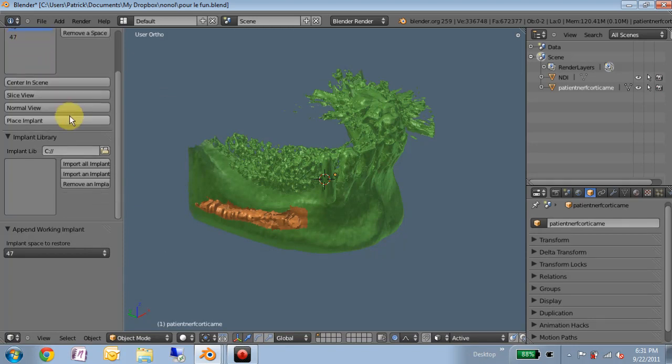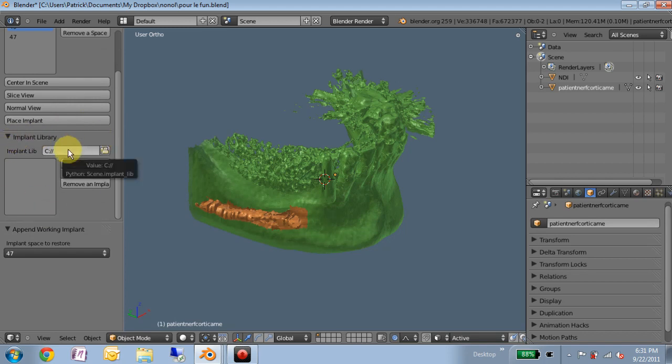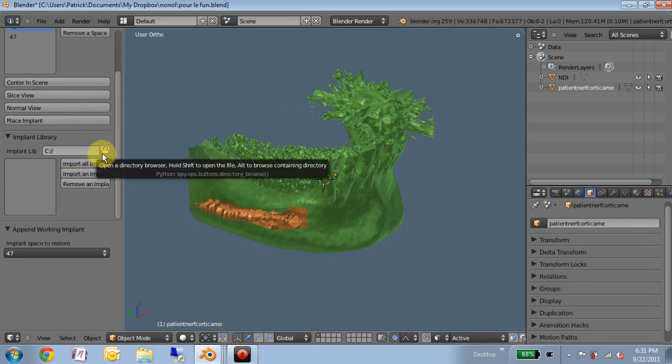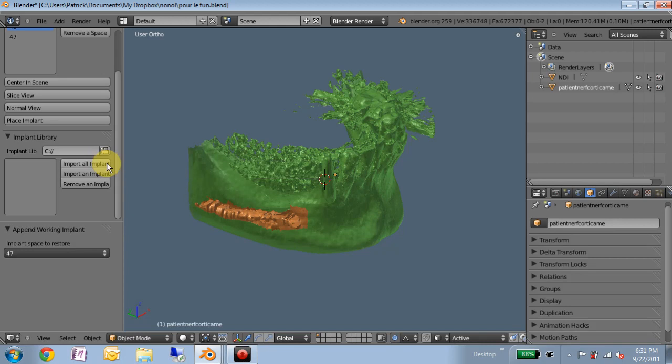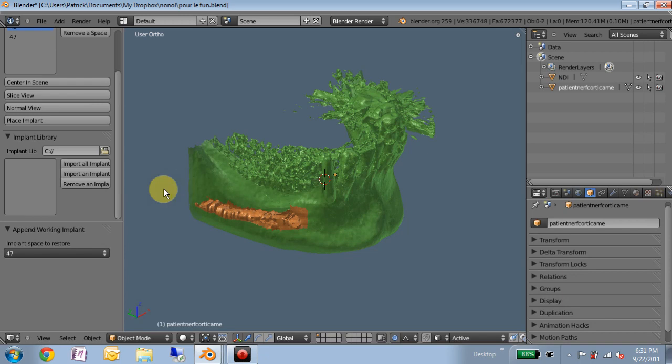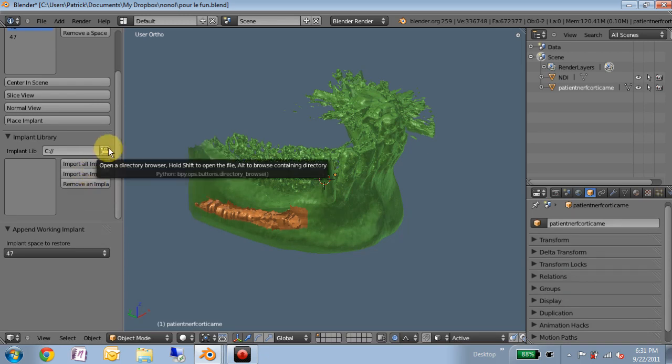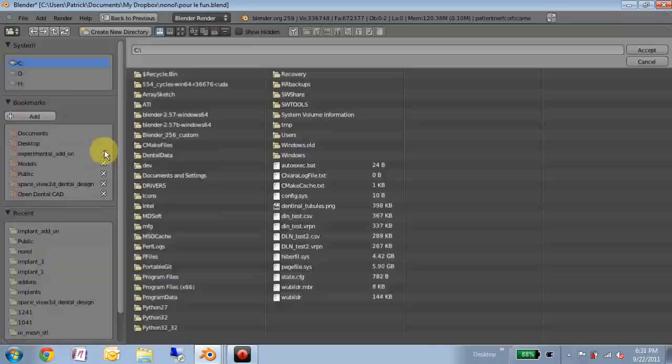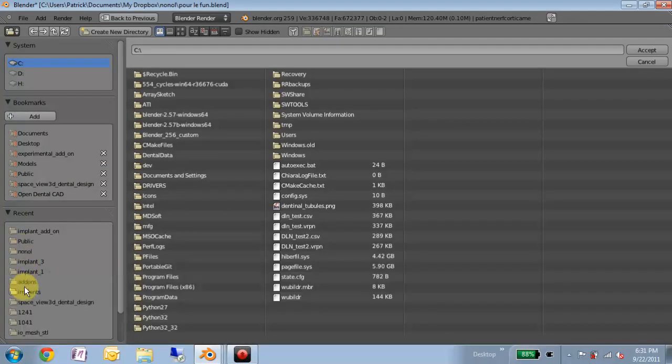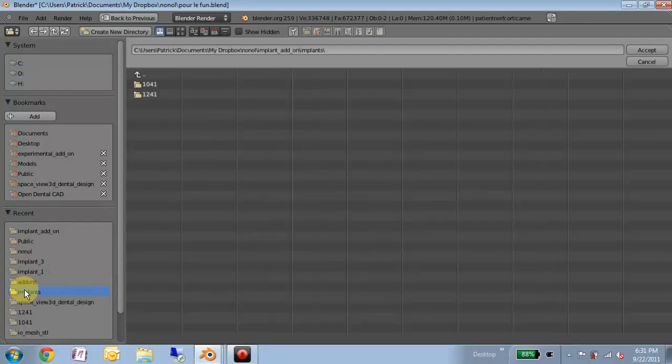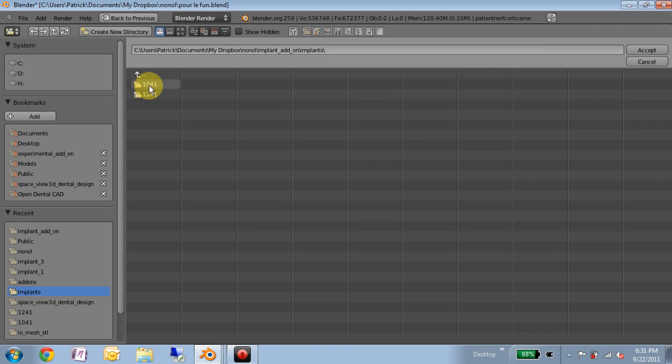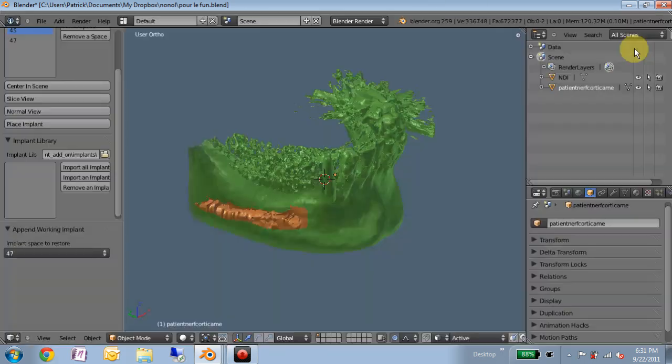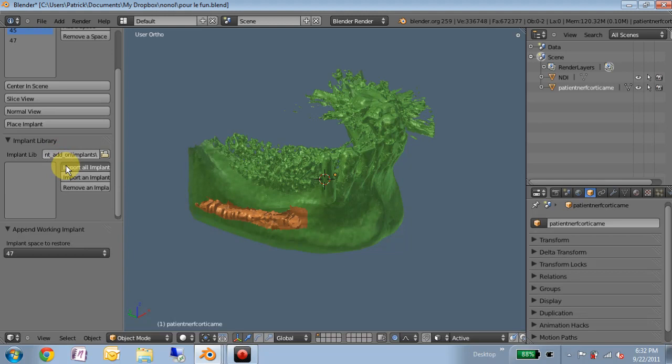Secondly, the implant library is something you should be able to set up one time and save the blend file and not have to adjust again. There's two options here. We can import each implant individually, or we can set a folder as the library and import all the implants in that folder. So if I choose this folder on my computer, which has these two example implants, that sets my implant library folder, and then I can import all the implants from that directory.